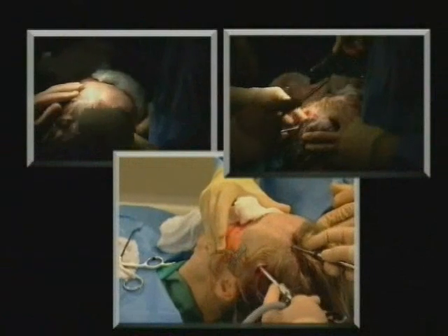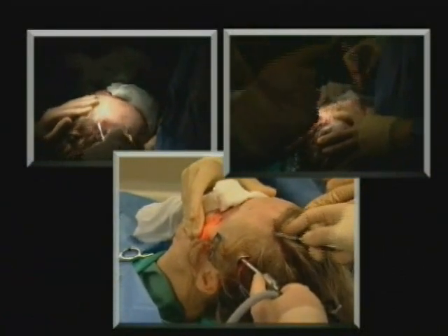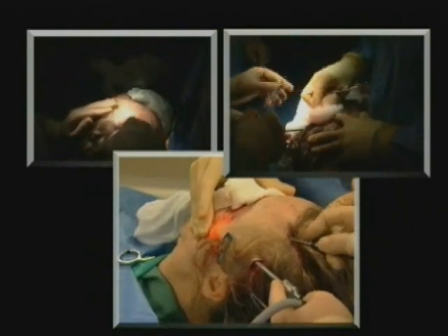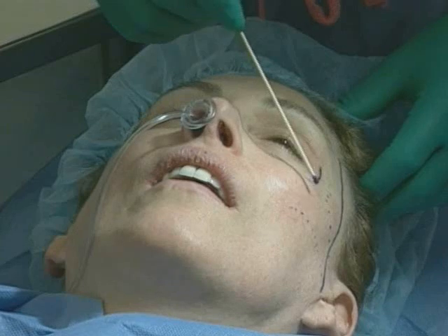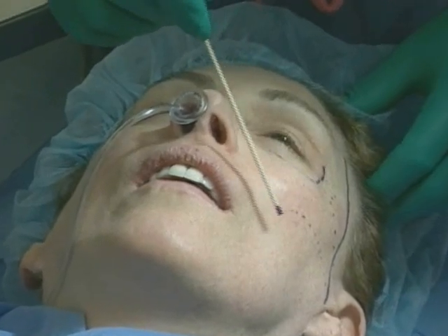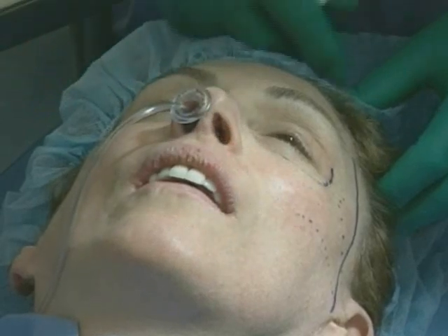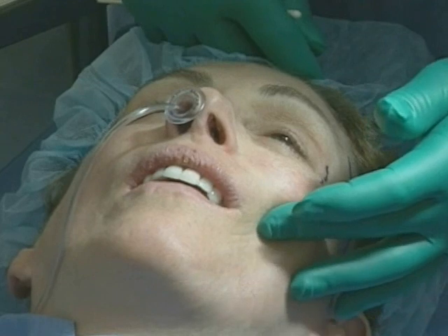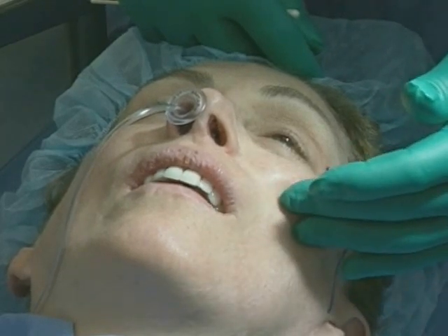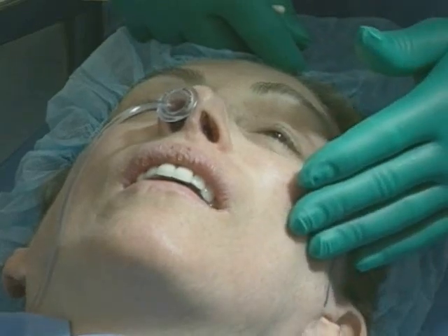The following surgical procedure represents one of several approaches that may be selected by the surgeon to perform a midface suspension with the endotine midface. If we look at the patient, we can see that we have our malar eminence, but there's been some descent to the malar fat pad and more laxity down in this area. What the procedure will do is elevate this malar pad, giving some more prominence to the malar eminence, but also removing some of the laxity in this lower jowl subbuccal area.